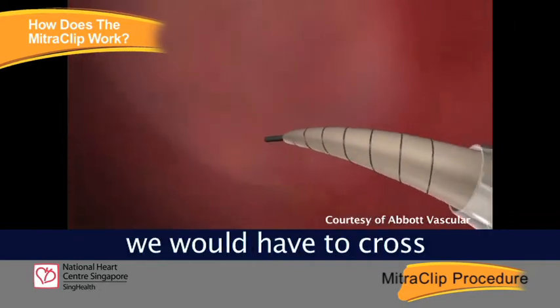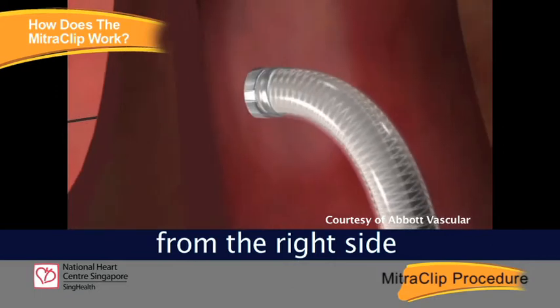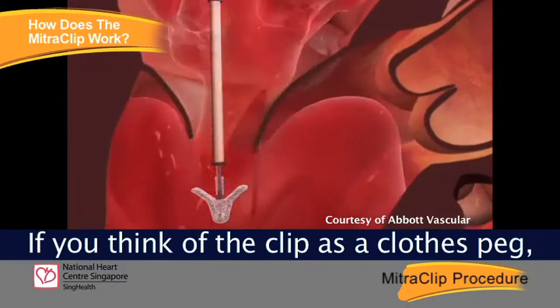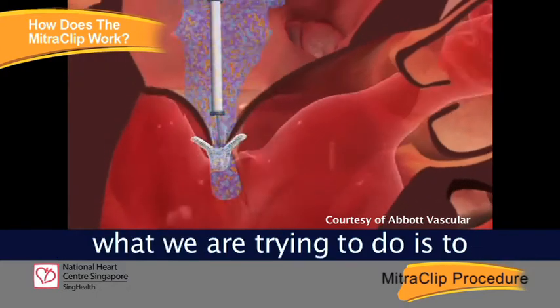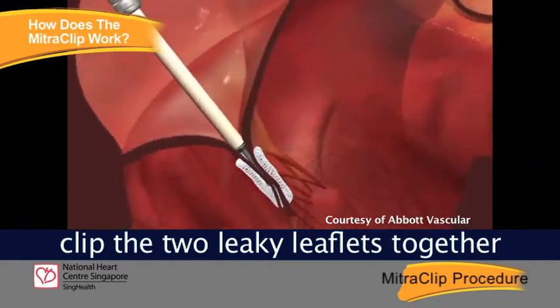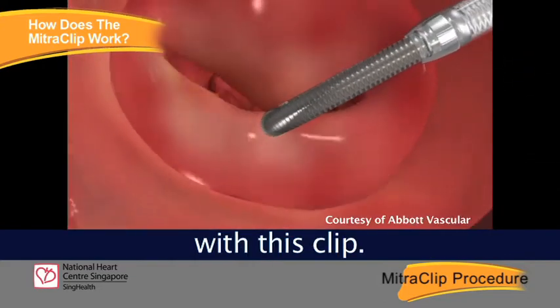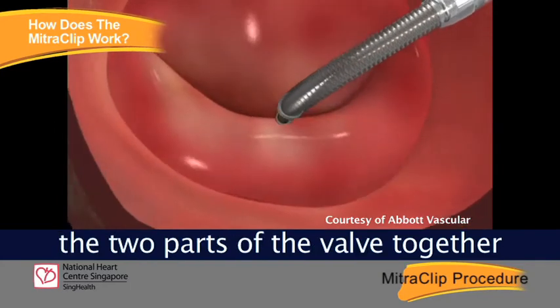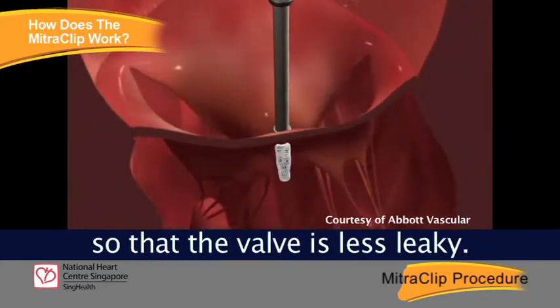In the heart, we would have to cross from the right side to the left side of the heart where we position this clip. If you think of the clip as a closed peg, what we are trying to do is to clip the two leaky leaflets together with this clip, bringing the two parts of the valve together so that the valve is less leaky.